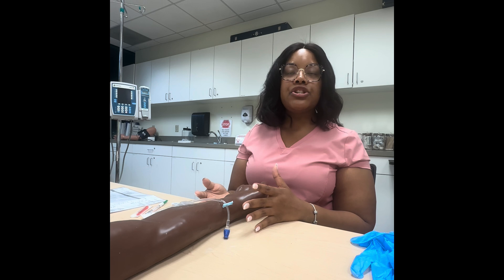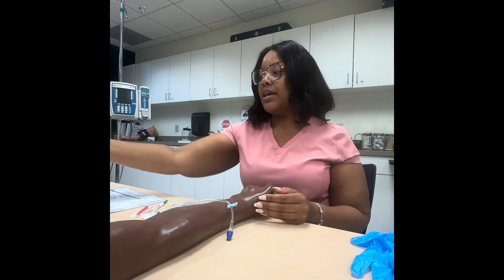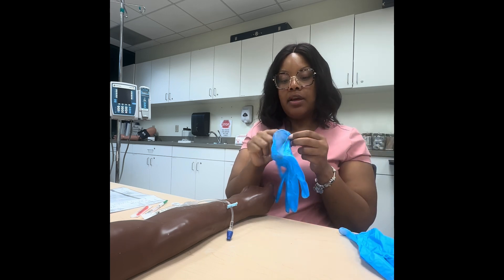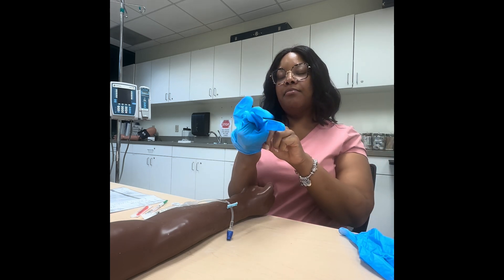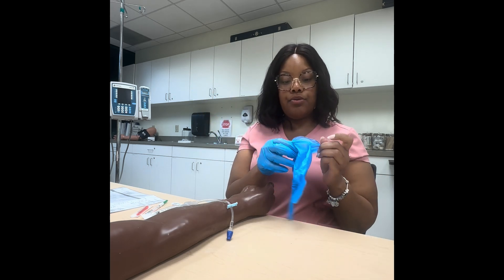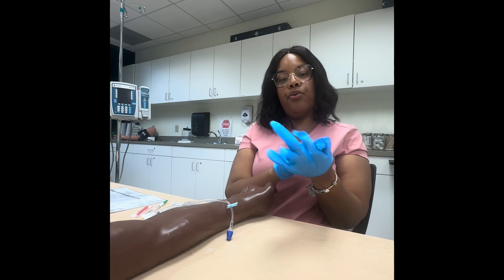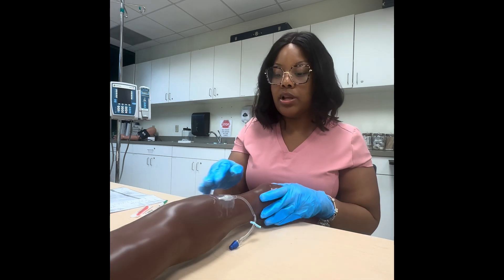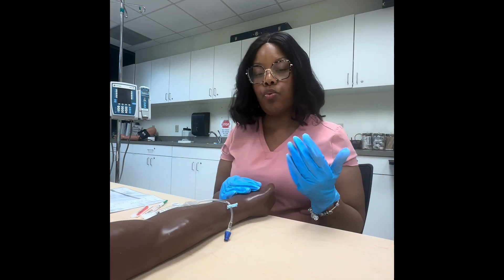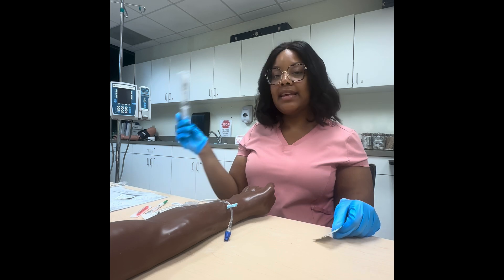Before we even get our medications, we're going to access our patient's IV site. Perform hand hygiene and verify your patient. We want to check out the IV before we get our medications — we want to make sure we have a working IV. I can't tell you how many times I had my medicine ready and the patient's IV was no good. What you'll need first is an alcohol swab and a saline flush.